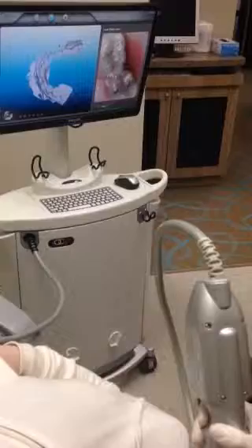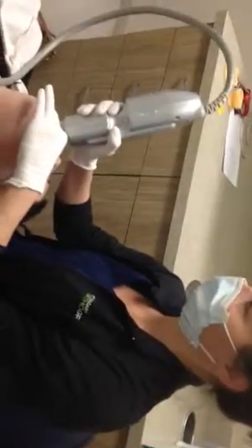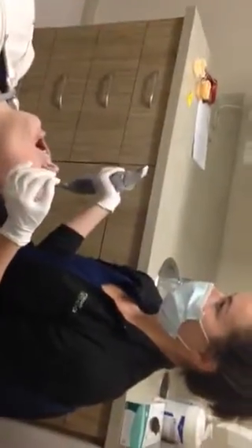Yeah, so the advantages of this scan are basically for gaggers, like if we need to make an appliance for someone and they're a pretty bad gagger, the amount of time you're in the back of their throat is like seconds versus holding the alginate there for a couple of minutes, so that helps for sure.